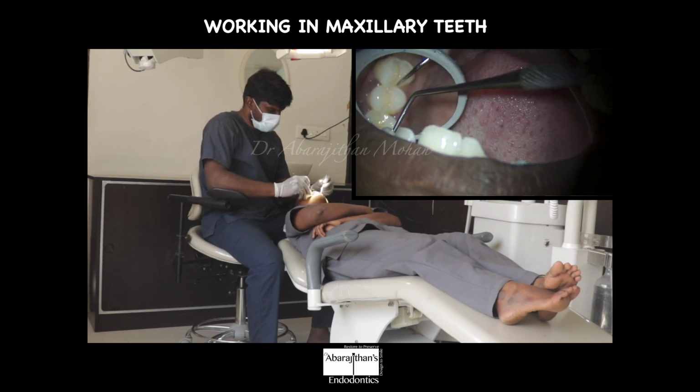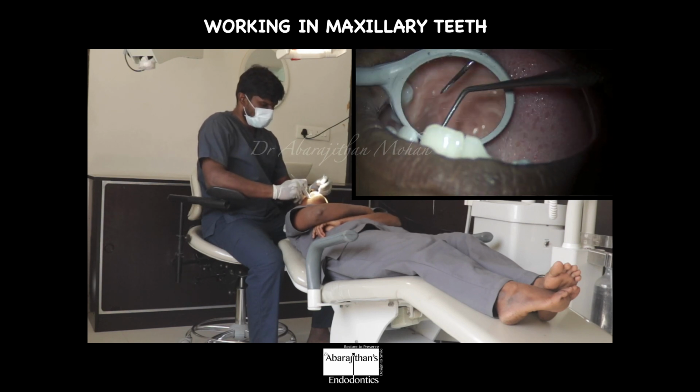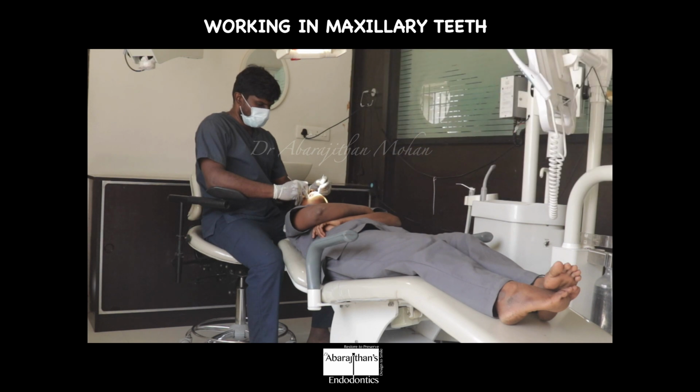And from this position you can see that the operator is able to examine any part of the maxilla comfortably, and the procedures can also be done from the same position. So these are the basic principles of ergonomics without complicating things further. I have tried to keep it as simple as possible, and the dentist needs to be thorough with this and make sure he implements this in his practice.